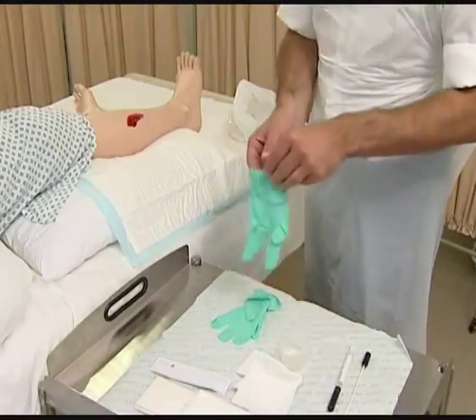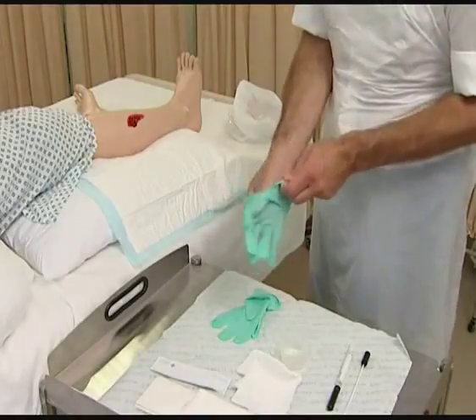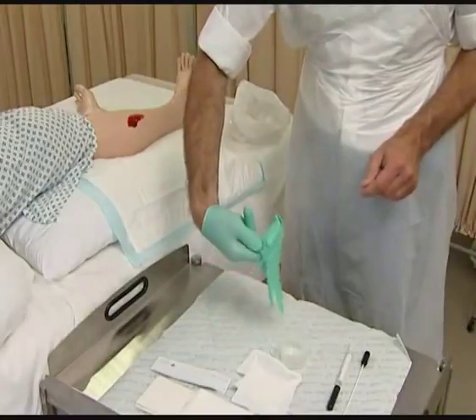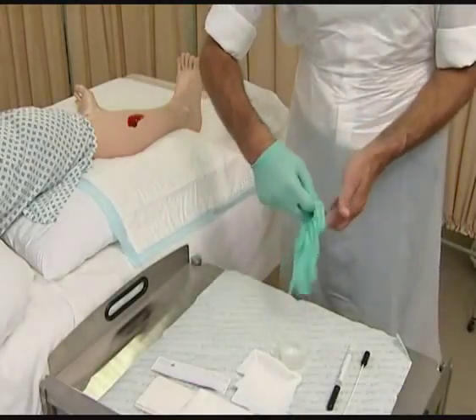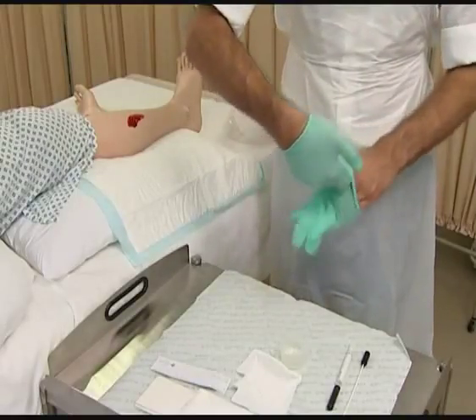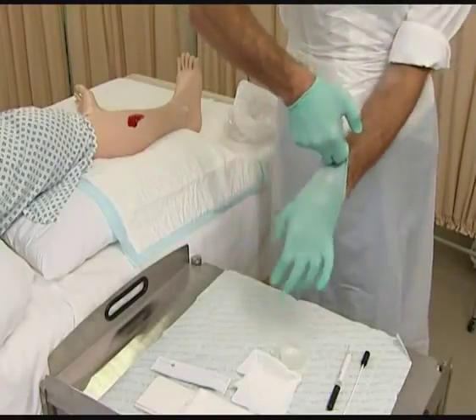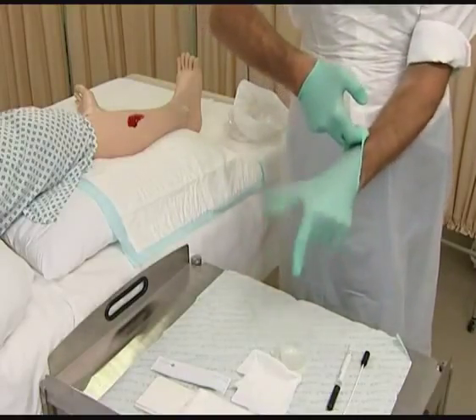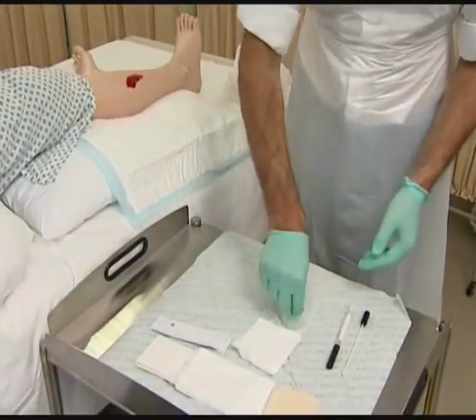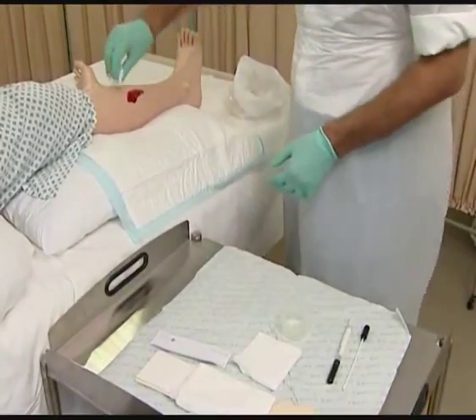Apply gloves from the pack without touching the outer glove surface. Clean and dress the wound and surrounding skin as appropriate and according to good wound care principles.